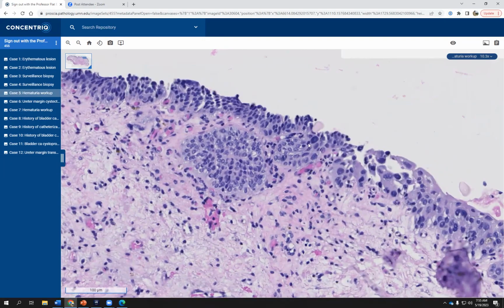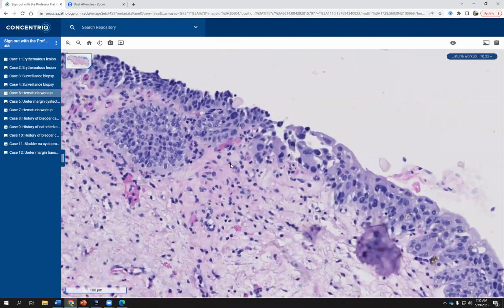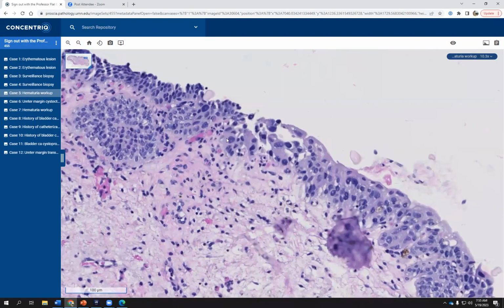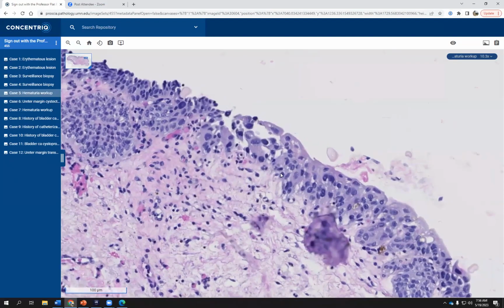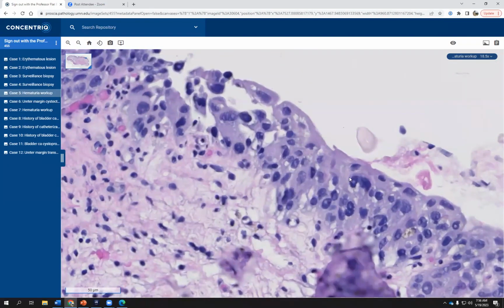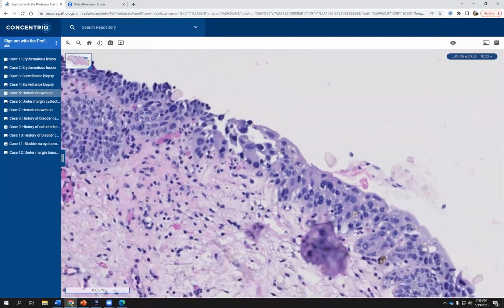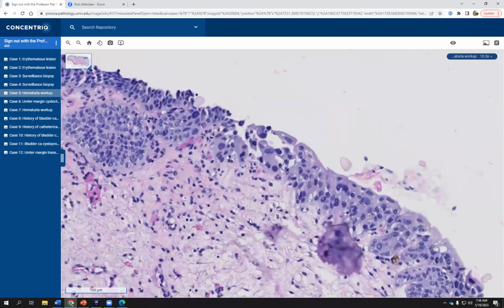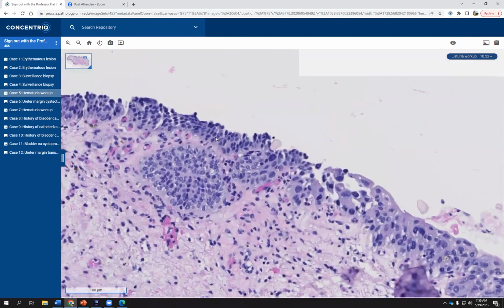And you see just this, you might think, okay, maybe that's just an umbrella cell with atypia. But then when you come over here, you clearly see it in deeper layers. And there is irregularity that is very concerning, both in terms of cytologic aspect and also architectural aspect. So there is a degree of disorder that we see over here, especially when you compare these areas and this area to the normal urothelium over here, you can clearly see that this area is different. So this is actually carcinoma in situ.